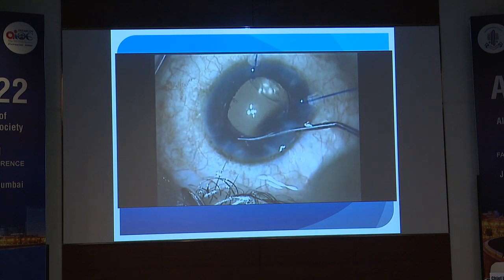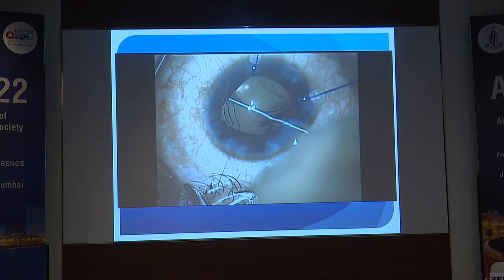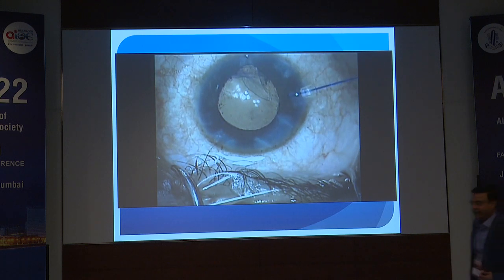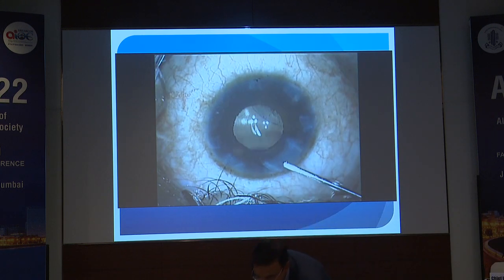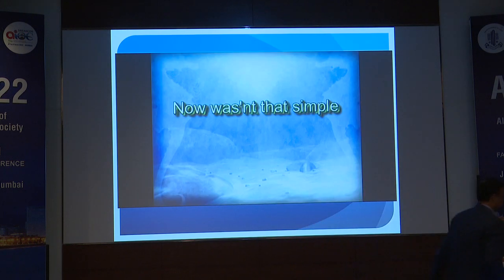One of the easiest lenses to use in this case is a Rayner, because it is sufficiently rigid to hold the bag in place and at the same time is friendly enough to remain there. And now that's as simple as that.